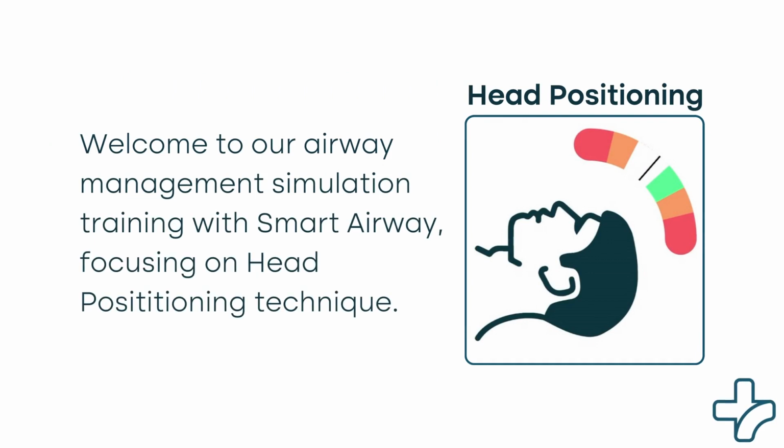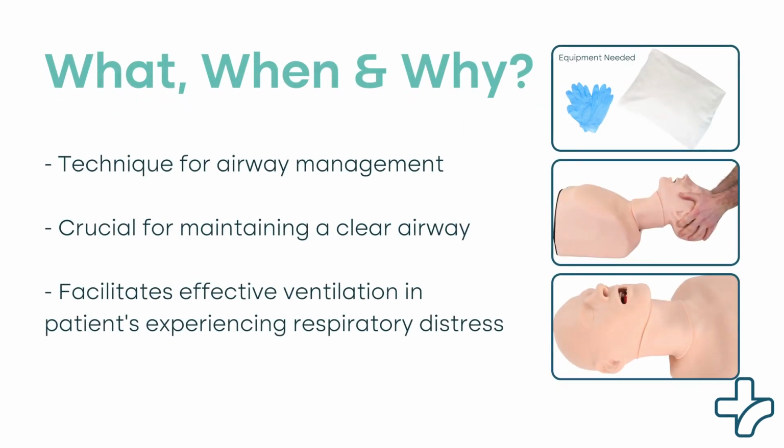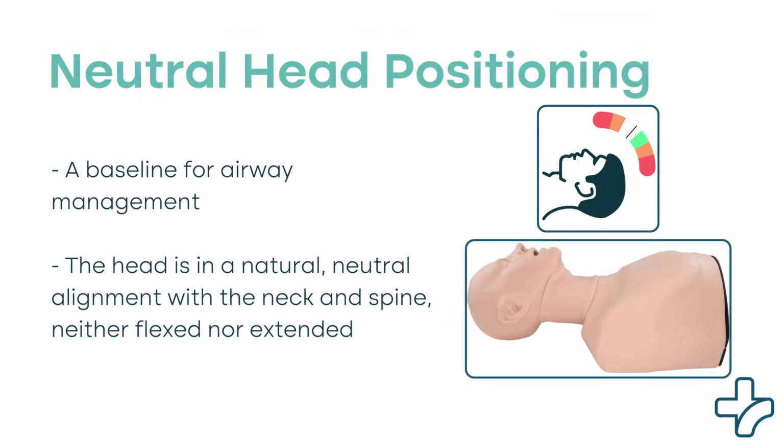Head positioning. Welcome to our airway management simulation training with Smart Airway, focusing on head positioning techniques. Proper head positioning is crucial for maintaining a clear airway and facilitating effective ventilation in patients experiencing respiratory distress or undergoing airway interventions.